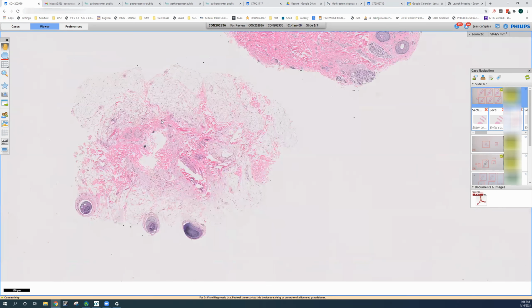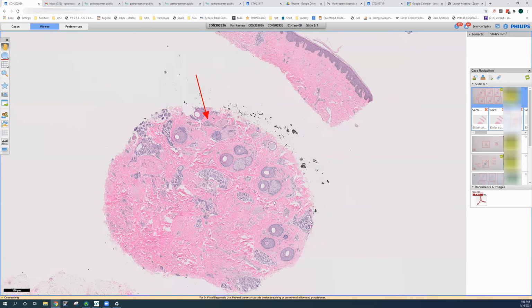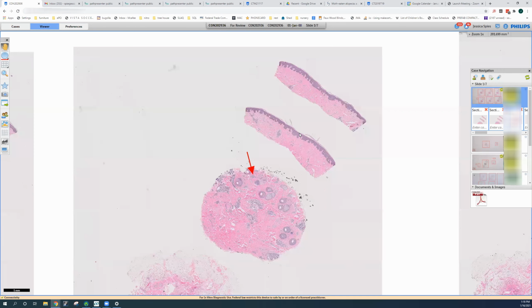So let's jump to the diagnostic slide. And I just want to point out also that this is a non-scarring alopecia. Syphilitic alopecia is a non-scarring alopecia. The precise mechanism is unknown, but it does resolve with treatment of the underlying syphilis. You can see eosinophils. We don't see that in this biopsy. And you can see a lichenoid or spongiotic tissue reaction pattern, which we don't see here in this biopsy either. You can even see neutrophils in syphilitic alopecia. It can also be non-inflammatory.